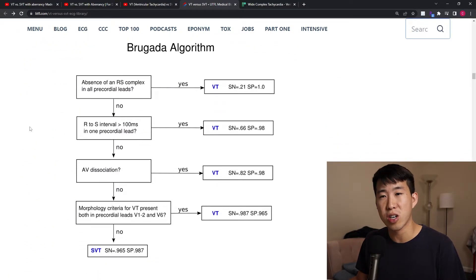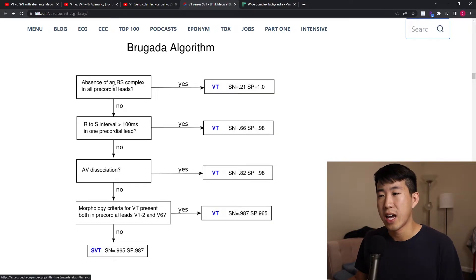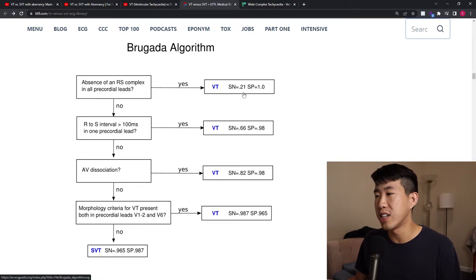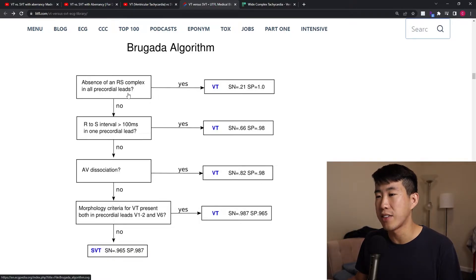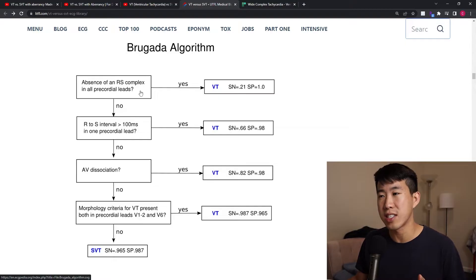Another important tool is the Brugada criteria — something cardiologists use frequently, but internists should be aware of. Basically, if any of the four questions in the Brugada criteria are positive, it's diagnostic for ventricular tachycardia, with very high specificities of 0.98 and 0.965. If all are negative, you can diagnose SVT with aberrancy. Let's actually go through what it looks like to apply the Brugada criteria.